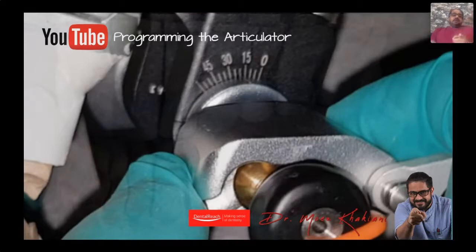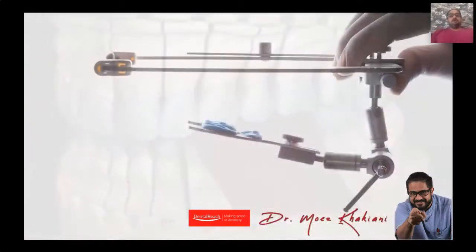Now, semi-adjustable articulators have one more added advantage. It allows me to record a Facebow. Now, why is a Facebow important? Because a Facebow firstly gives me the angle of the maxilla. Remember, maxilla could be superiorly based, it could be inferiorly based, depending on the length of the face: long face, short face, broad face, narrow face. How often do we see maxillas that are a little canted off? So it gives me the cant.